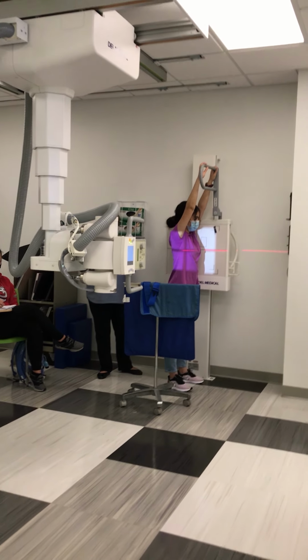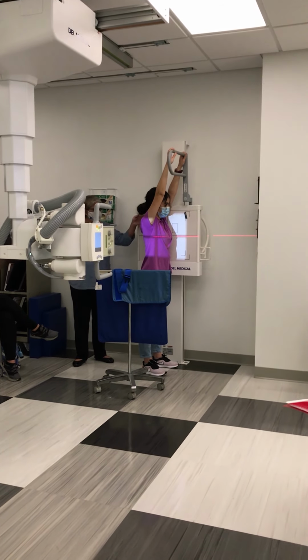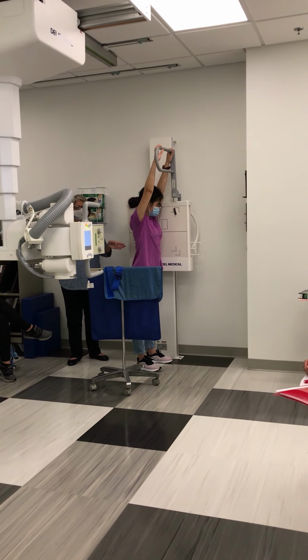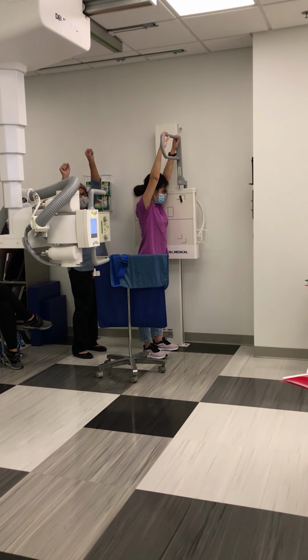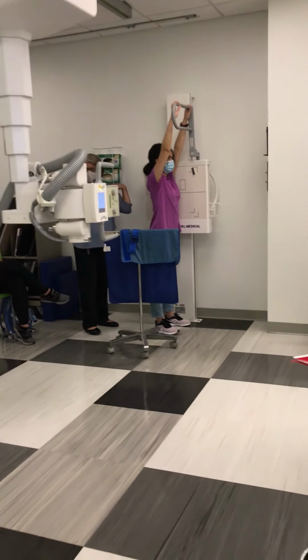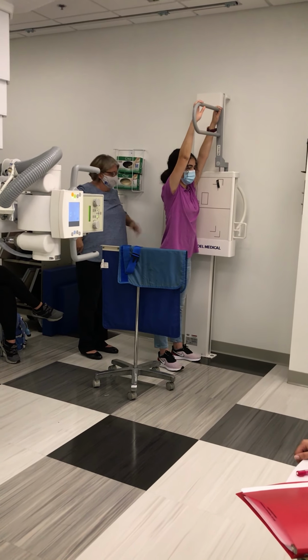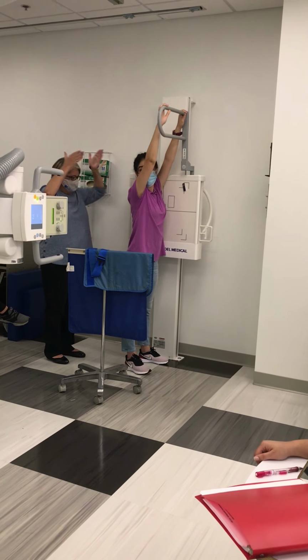But I will tell you that some people are built in a way that their shoulders are against the wall bucky, but if we got their hips against the wall bucky, that would mean they'd be leaning over to do that, and you don't want that. So somebody who has kind of broad shoulders and narrower at the hips, you may have that little bit of gap at the hips, but they're standing straight.